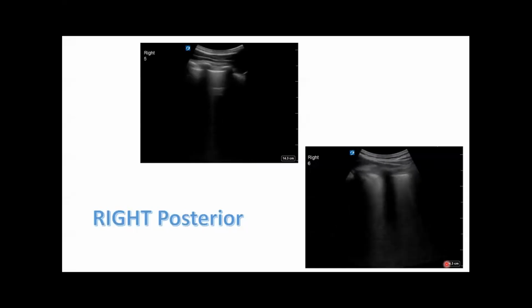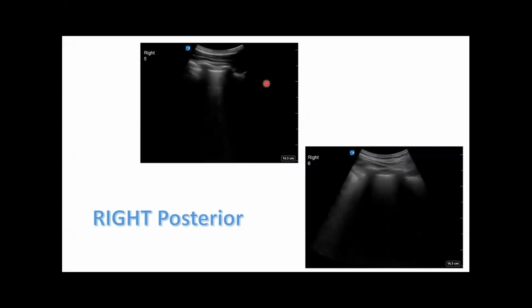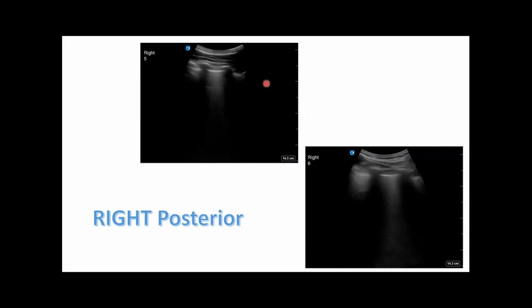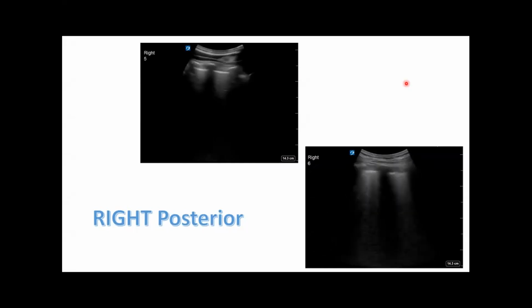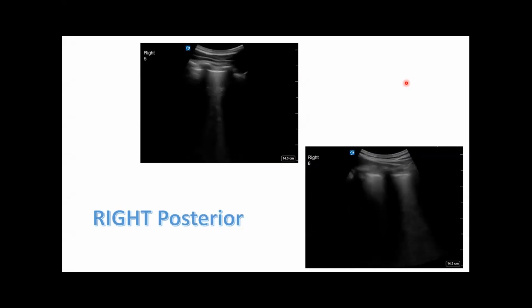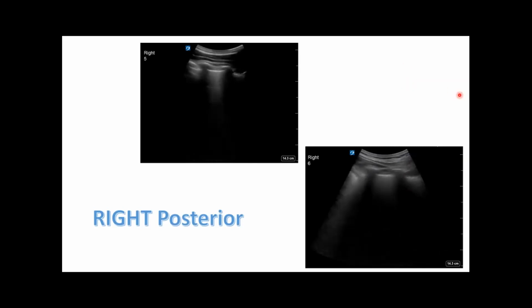Yeah, sorry. And sometimes in the resuscitation room, we actually use ultrasound to help us differentiate those who may have a primary respiratory or some secondary cardiac problem with pulmonary edema. So you have a patient coming in with respiratory rate 40, the patient is hypertensive, you look at the medications, the patient is on albuterol, and they're also on Lasix, and you're thinking, is this CHF or COPD exacerbation, or a combination of both? And one thing we can also do in those settings is quickly take a look at the patient's lung windows. And in those with clear flash pulmonary edema, you see the B lines.